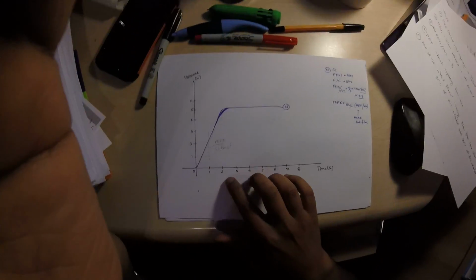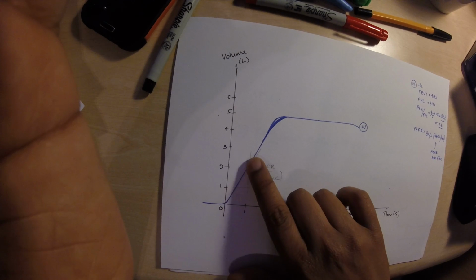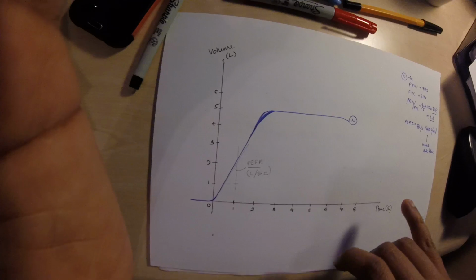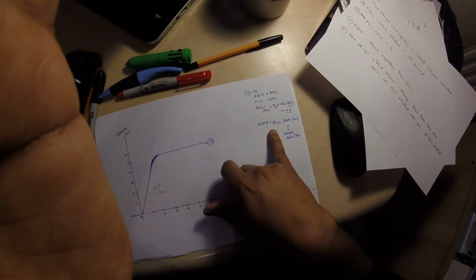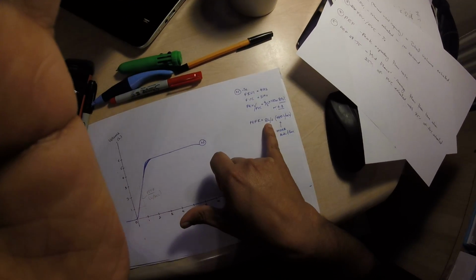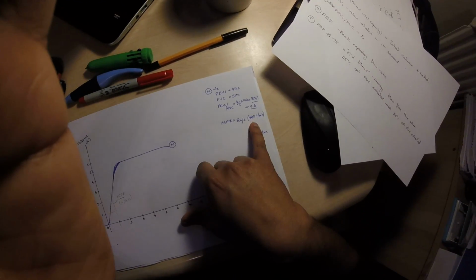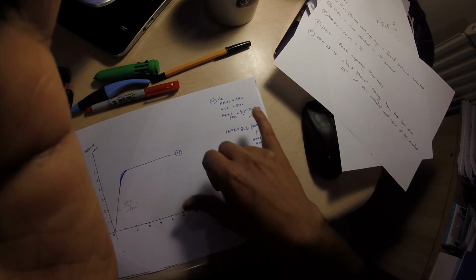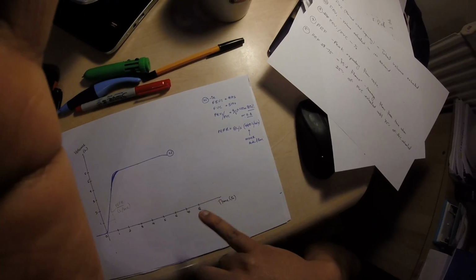The peak expiratory flow rate is calculated in this first second, on the inclination of the graph, and for a normal individual, the blast of air that comes out of their lungs in the first second or first half second can be up to 8 liters per second. That would be equivalent to 480 liters per minute on a home peak flow meter. So that's what I understand from the basic numbers that we see on the peak flow meter.